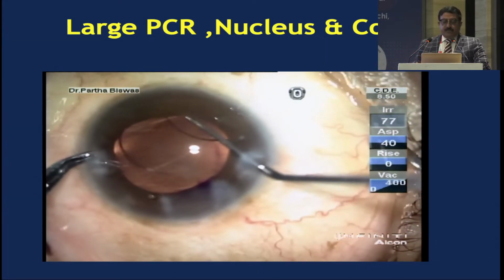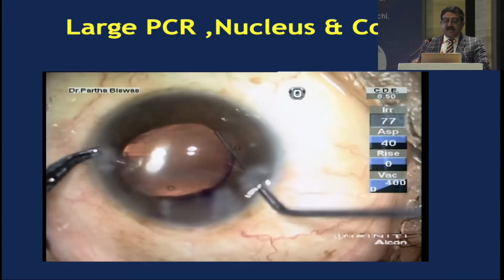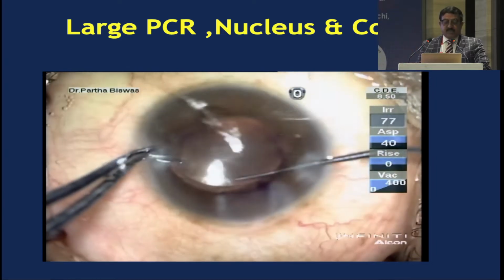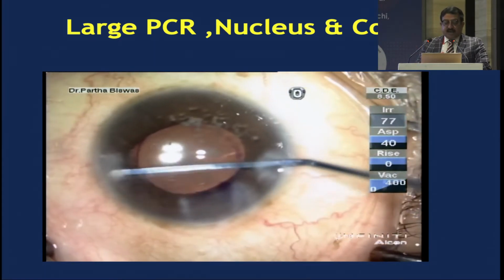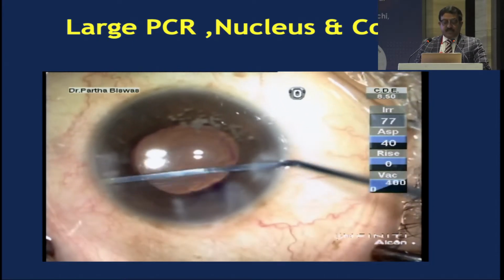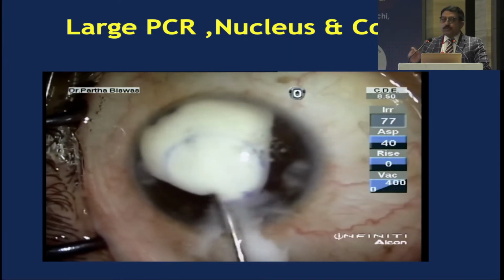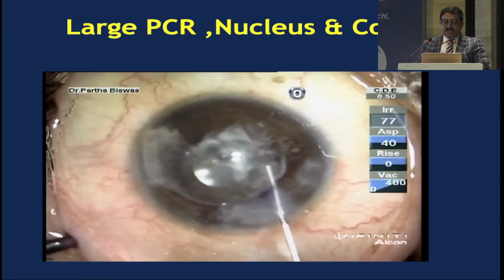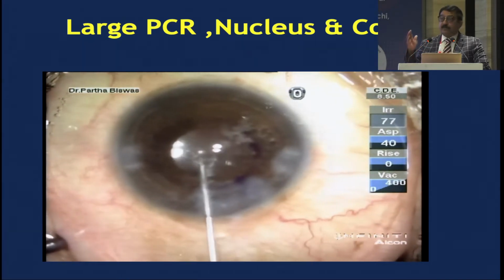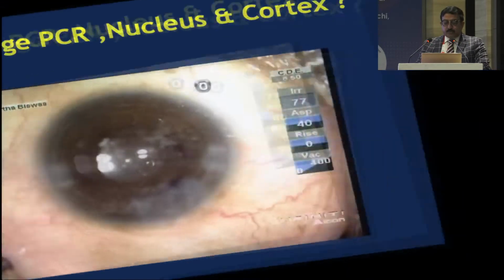And in this case, we are placing a 3-piece IOL in the sulcus. You have to be very sure that both the haptics have gone into the sulcus, and then you go ahead and capture it and place in triamcinolone. If there is any amount of vitreous, please do anterior vitrectomy and then only close the case. So triamcinolone works in two ways. It shows you, yes, there's a vitreous tag, or no, there's no vitreous tag. The other thing is, next day, the cornea is much better than if you have not used triamcinolone in the anterior chamber. So definitely use triamcinolone.